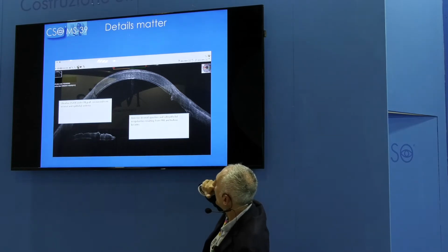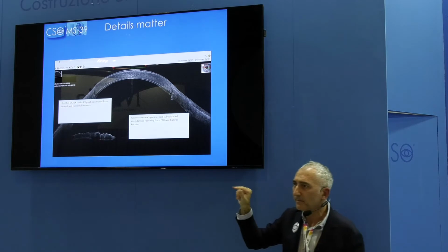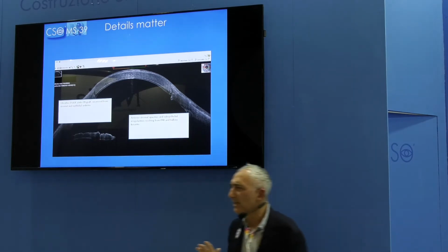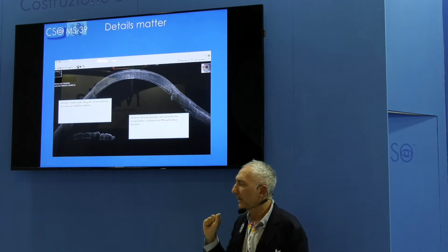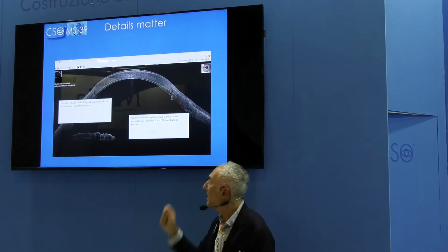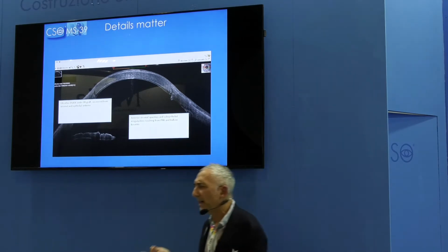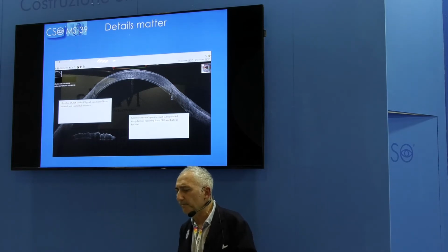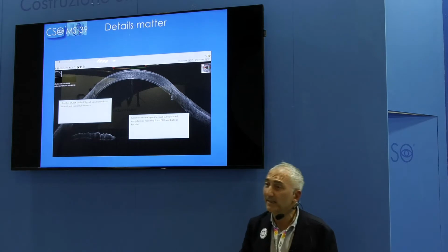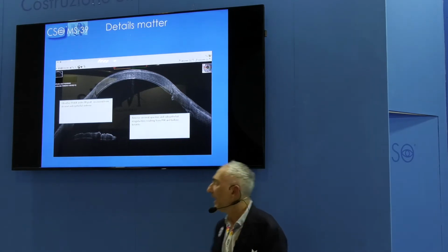One is that below the epithelium the surface is not regular, and it's not regular in a way that couldn't be only the effect of decompensation of the cornea. There is something, in fact I asked the patient, but didn't you have any laser after your penetrating keratoplasty, then he recalled that he had actually.